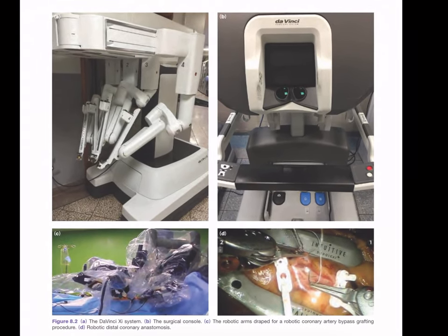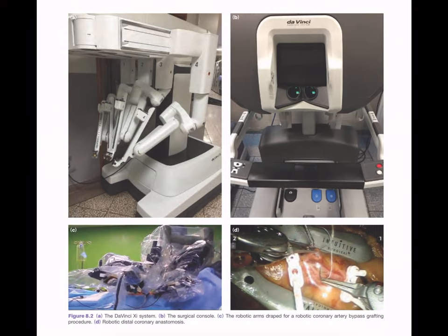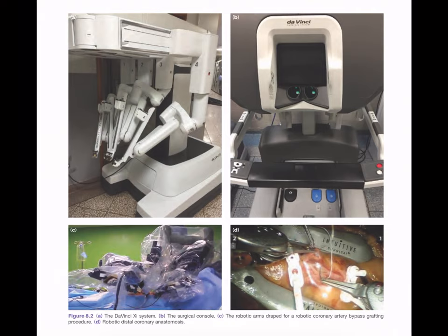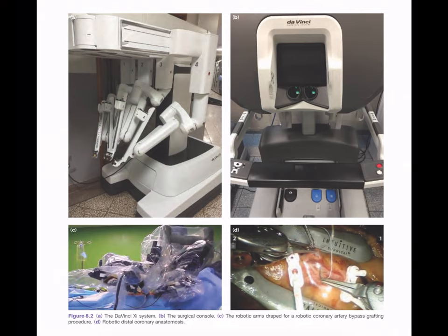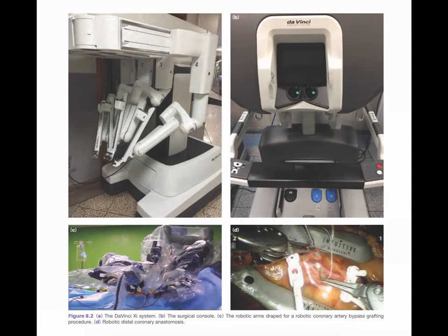Figure 8.2 shows four diagrams: (a) the da Vinci system, a robotic machine used for surgery; (b) the surgical console of the da Vinci system used in the operating theater, on which the surgeon sits and operates the robot; (c) the robotic arm draped for a robotic coronary artery bypass grafting procedure; and (d) robotic distal coronary anastomosis being performed.